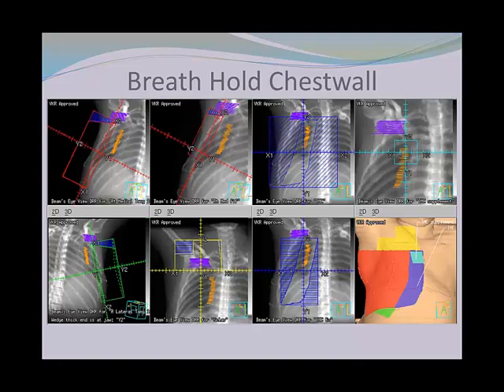And then on this, because of the patient anatomy, for the IMC field, we actually have to use a very high electron energy of 16 MeV the entire way. But usually the physician, if we have to use 16 MeV for 25 fractions, they worry about the skin dose. So here, generally, we would do a 4-to-1 ratio of photon to electron. So we would treat 4 fractions of electron to 1 fraction of photon every week.